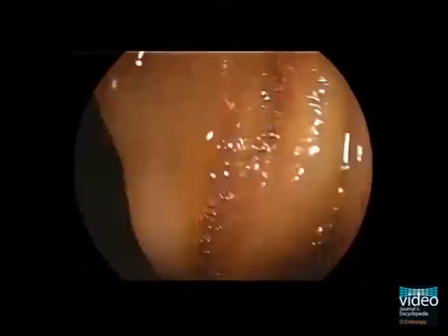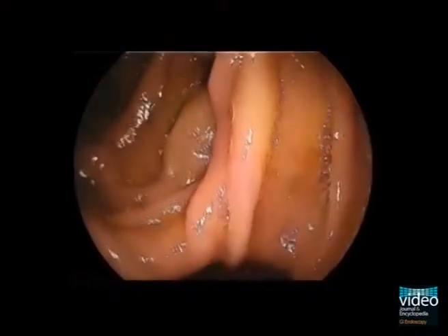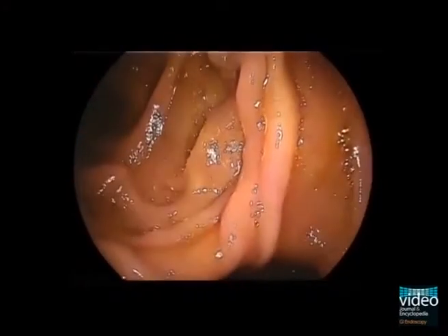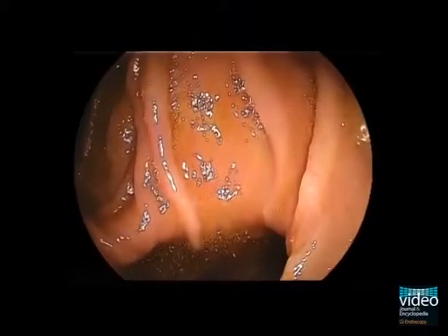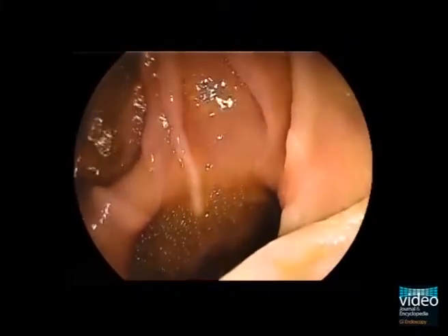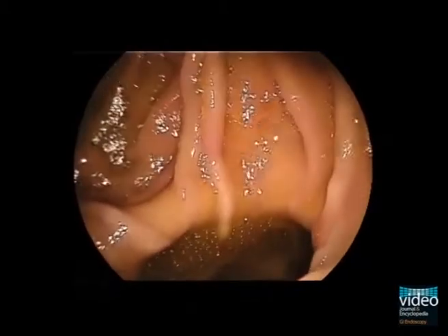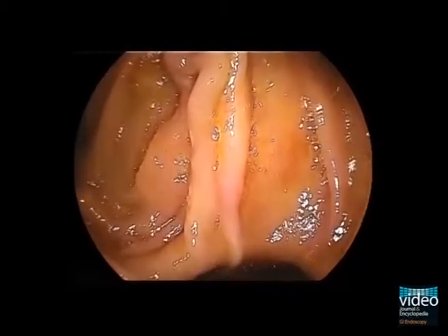Great care should be observed when entering an acquired small intestinal diverticulum with an endoscope. Acquired diverticula are pseudodiverticula, so their wall consists only of mucosa and submucosa that herniates through a hole in the muscle layer.